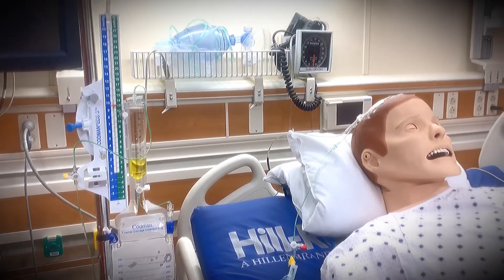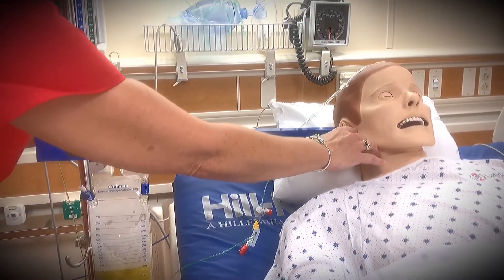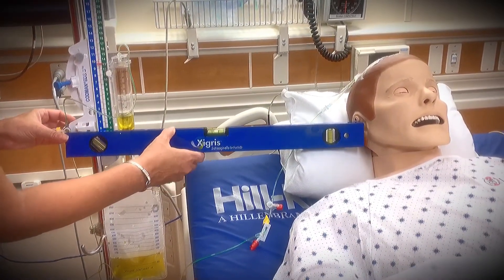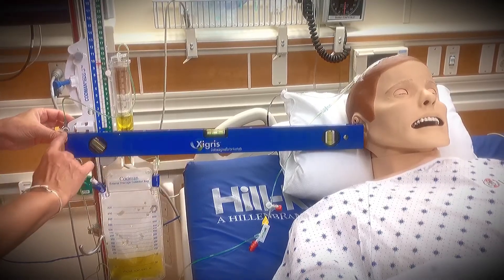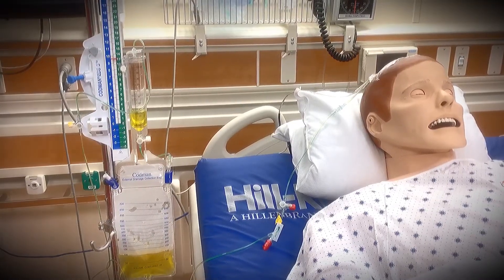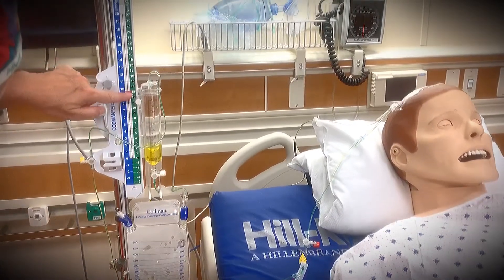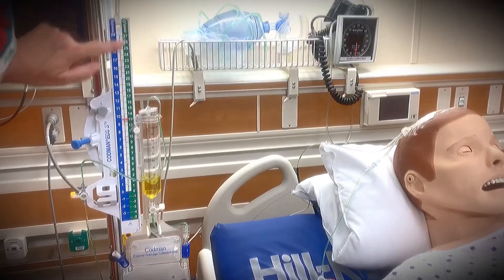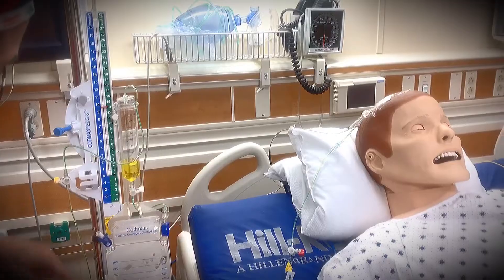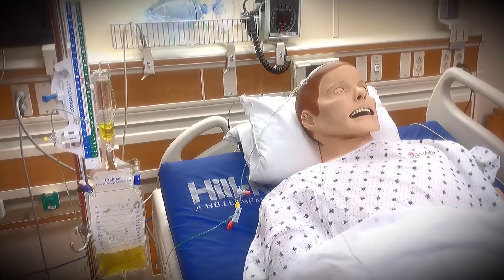Then I'm going to obtain my level. From the EAC or tragus, I am going to place my level there and right at the center of the stopcock, and make sure that it is leveled to the right spot. Then I'm going to make sure that this drainage is leveled at my 13 centimeters of water above the external auditory canal. So I know that the system is open, that it is draining properly, and I've got my drainage characteristics and my site characteristics.